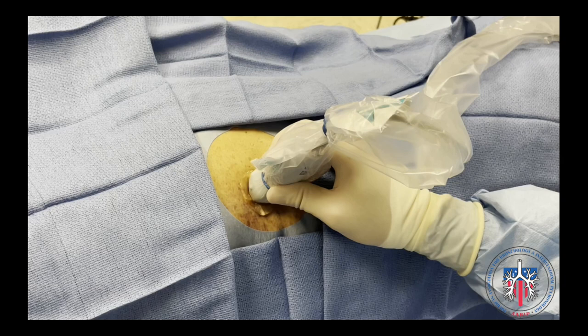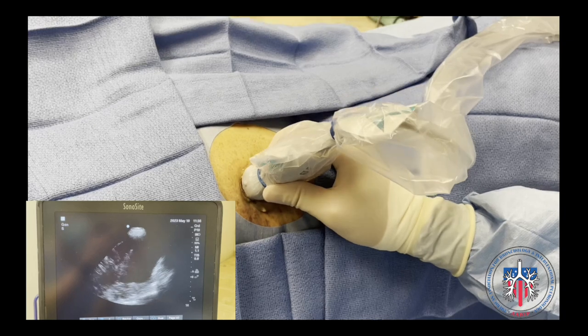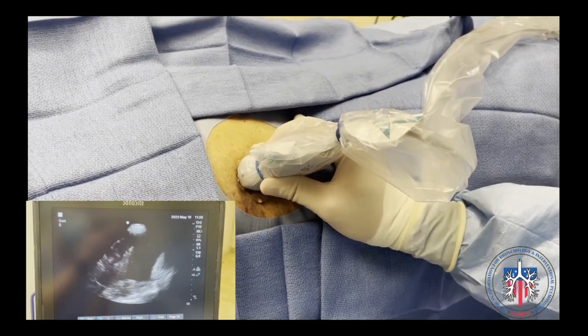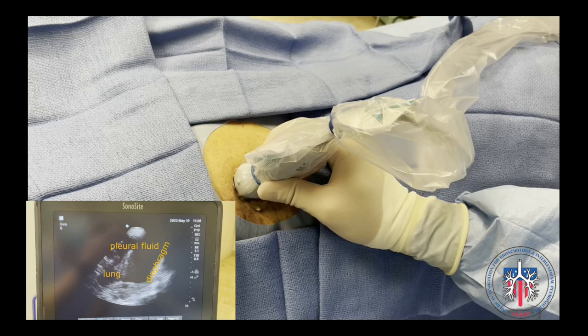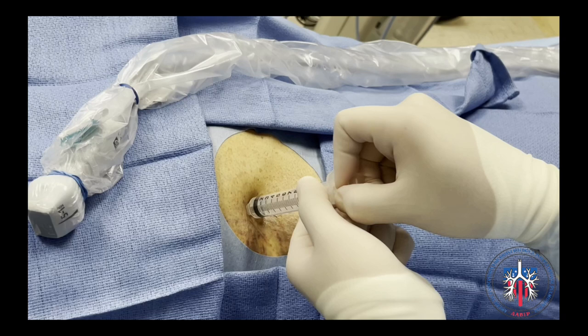After the patient is placed in the optimal lateral decubitus position with the target hemithorax facing up, the pleural space is evaluated with an ultrasound. The phased array ultrasound probe is manipulated until an optimal view is obtained. Here we can appreciate the lung, pleural fluid, and diaphragm in this ultrasound image. Once the optimal location is identified, the location is marked.